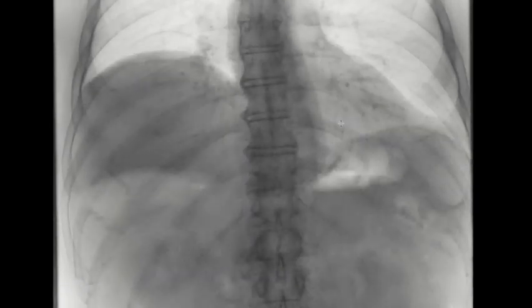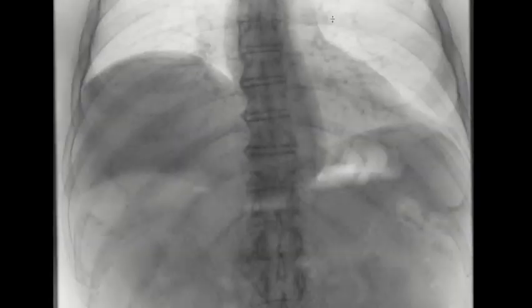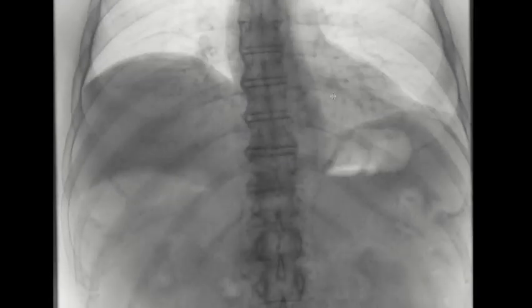The goal — and this is why the test is called a sniff test — is that by having the patient create a forceful sniff, you will see a difference between the hemidiaphragms that will be accentuated.